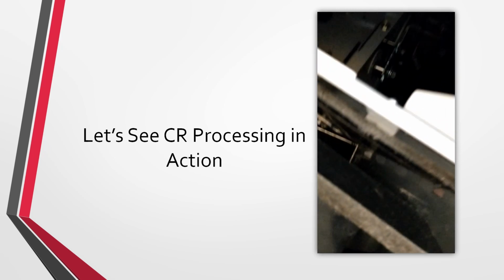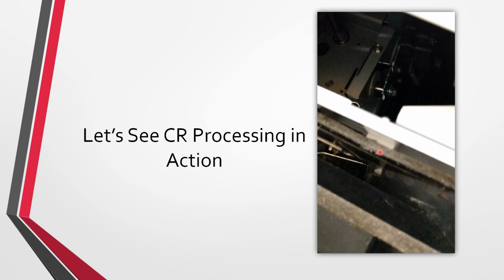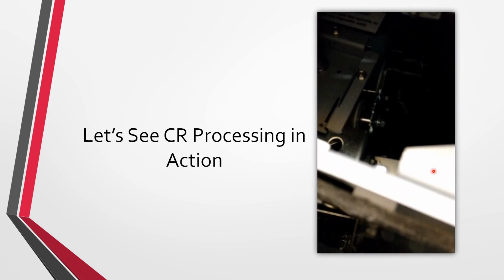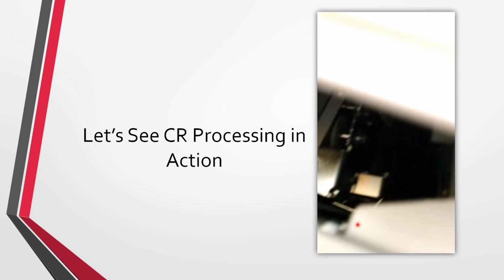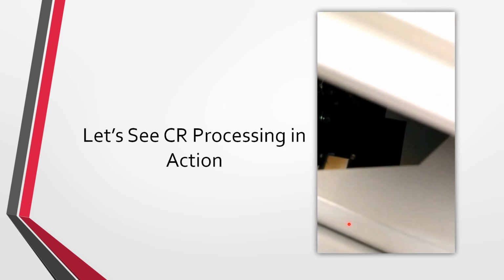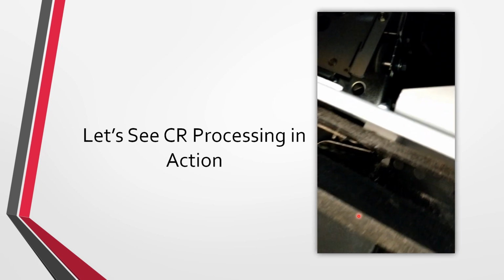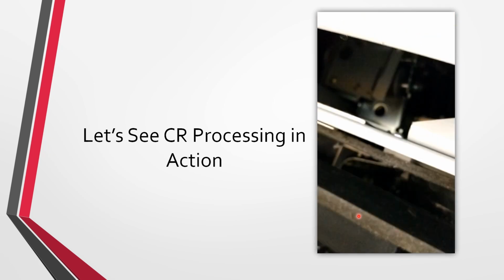Like I said, it's going to go in. It's going to open up here. Suction cups are going to come in and take the image plate and bring it down to the laser in the motor apparatus. We'll hear the laser here in 1 second. Here it is. It's going to move at a very steady pace.